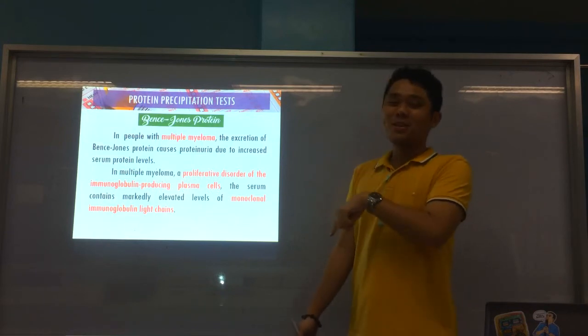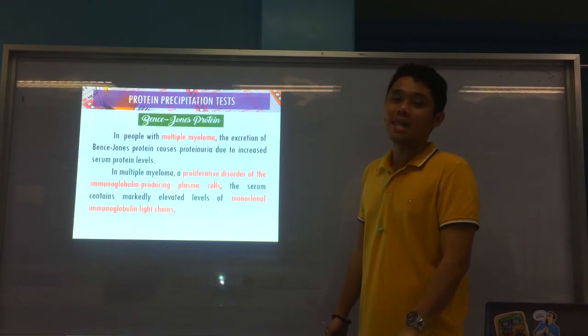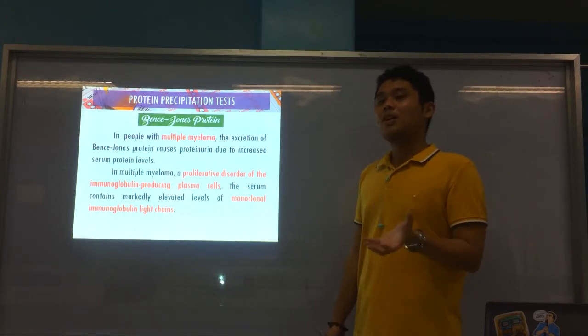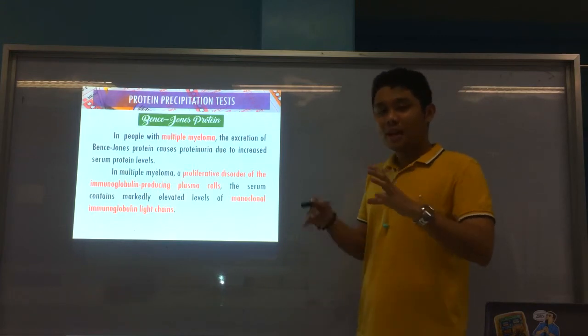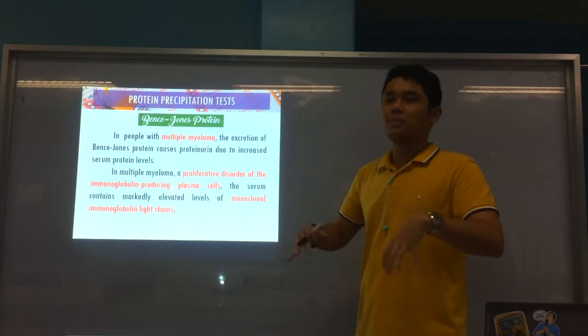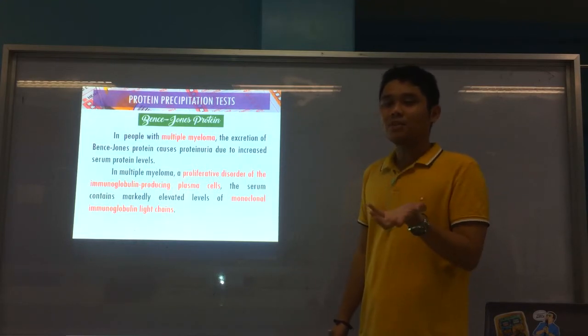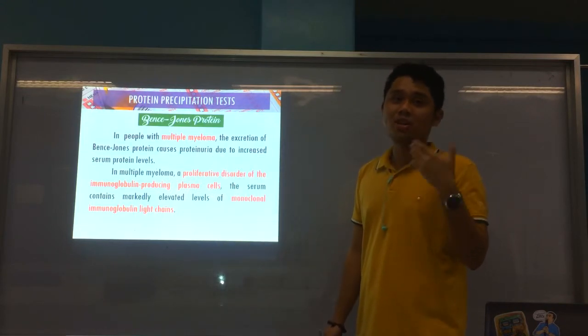Char. Okay, the Bence-Jones proteins or your BJ protein. Again, asa ni siya makitaan? It's seen in patients with multiple myeloma. And what is again multiple myeloma? Multiple myeloma is a type of cancer. It's an immunoproliferative, it's a proliferative, meaning kapadayon na ang divide sa cells. Of unsa na cell? Plasma cells. And again, these plasma cells, they produce immunoglobulins, or your immunoglobulins known as your antibodies.